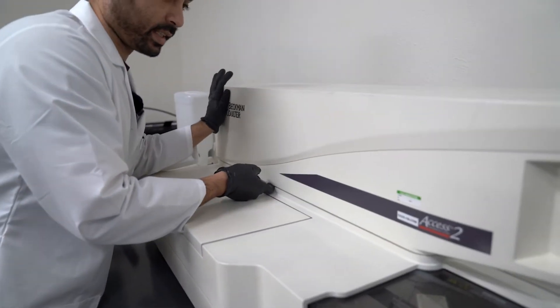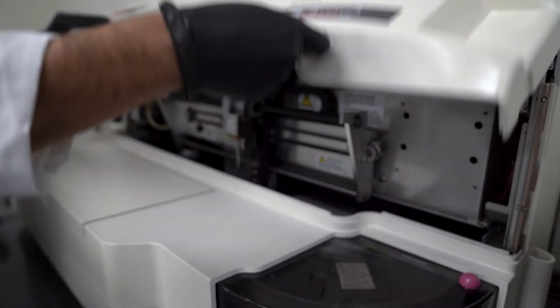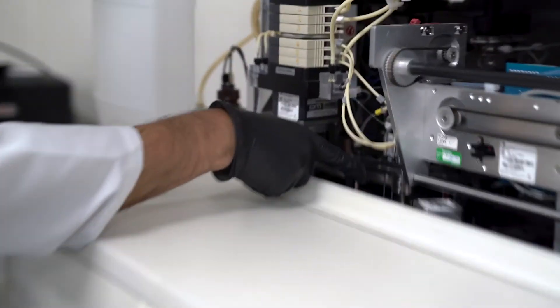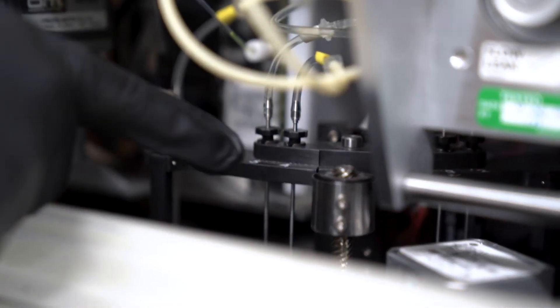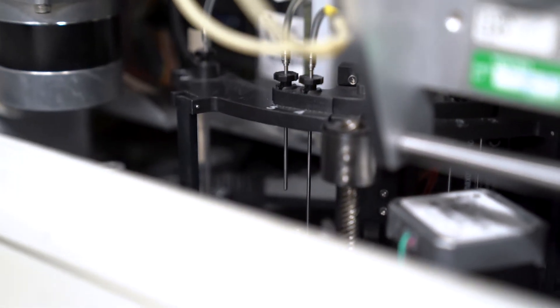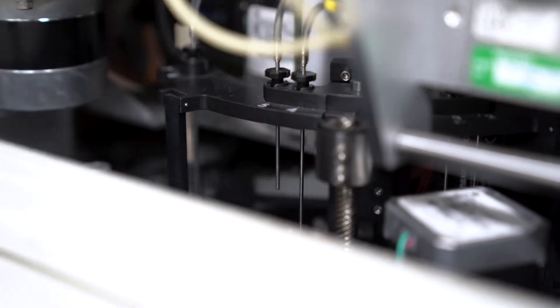Now we're going to clean the wash carousel probes. You open this up and here are the probes right here. Take an alcohol wipe and simply wipe them — you can even pull them out if you want to do a deeper clean — but as long as they're clean you're going to be good to go.